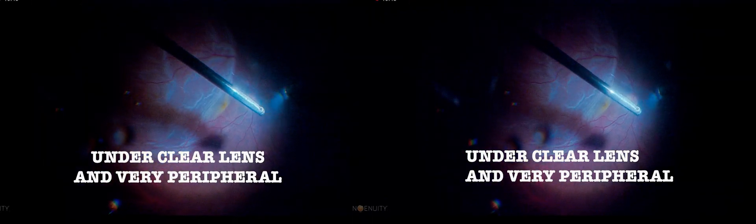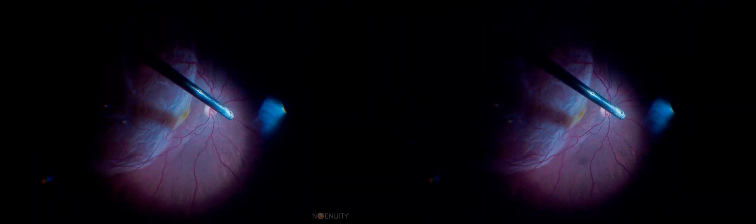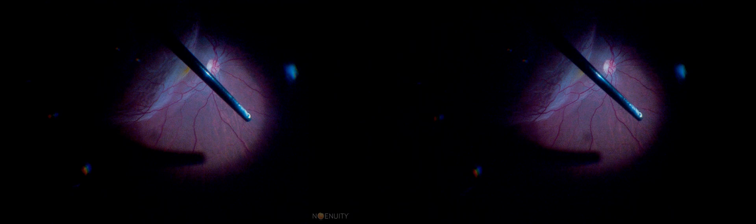Core and peripheral vitrectomy are carried out and the eye is moved toward the far periphery without touching the lens. Even a very peripheral retinal degeneration such as white-without-pressure can be noticed, and the appropriate duty cycle with high cut rates and aspiration are safe for the procedure.